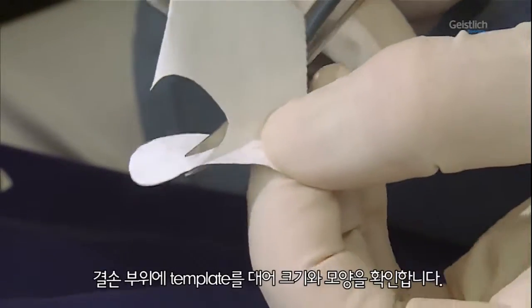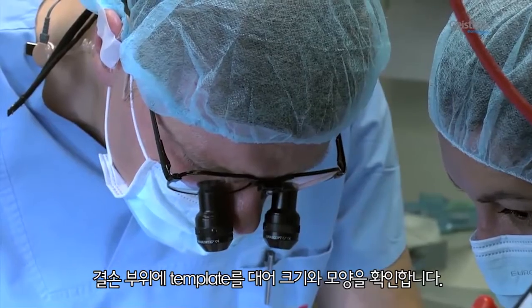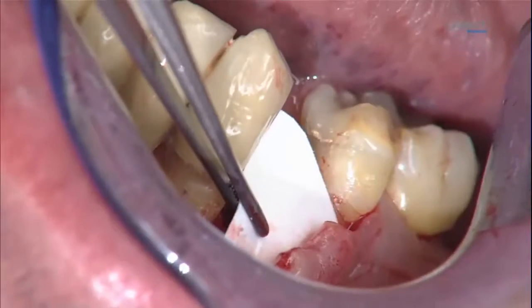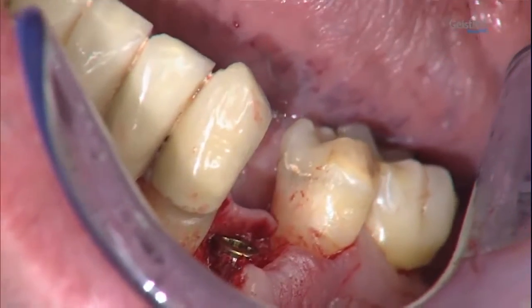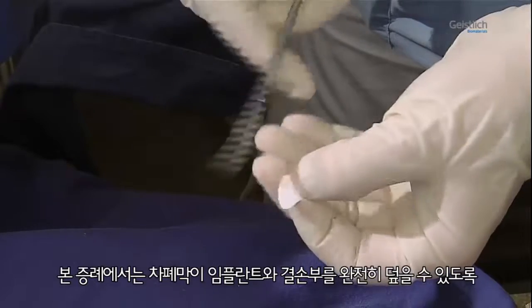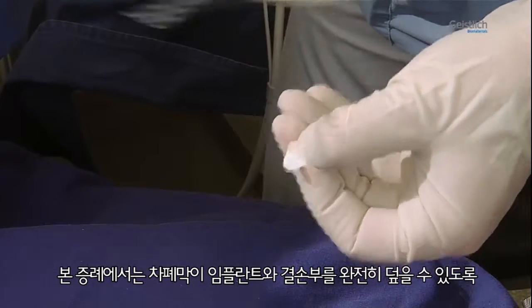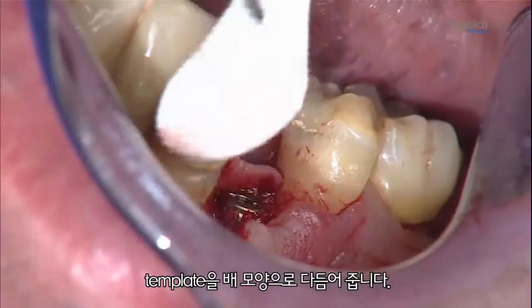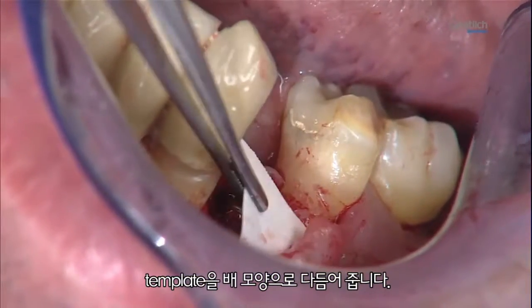To this end, we cut the template to size and hold it against the defect to check its dimensions. In this case, the template is further adapted to attain a pear-shaped form, ensuring that the membrane will completely cover the implant and the bone defect.